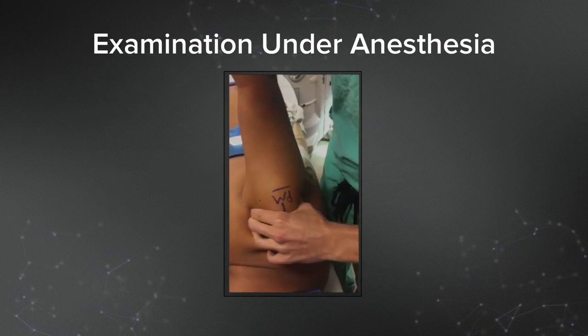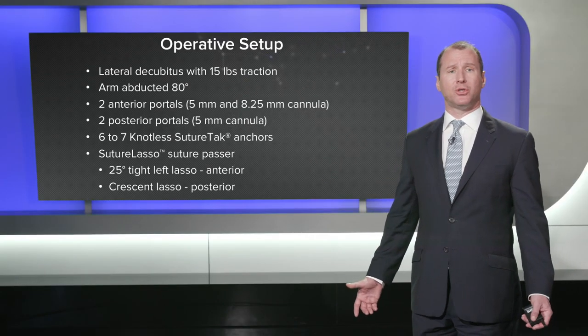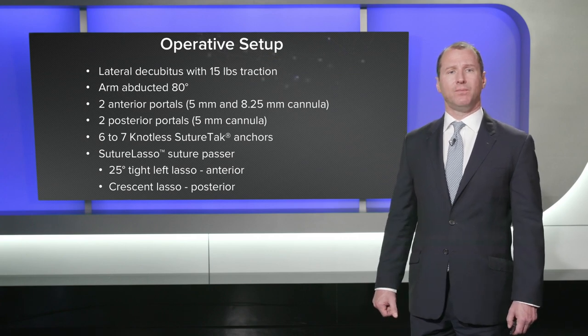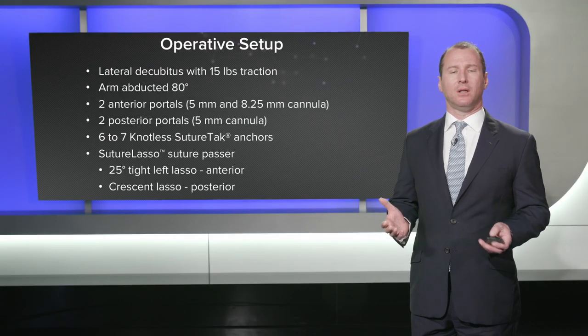Here you can see the examination under anesthesia, demonstrating significant translation over the rim both anteriorly and posteriorly. Our operative setup for a pancapsular shift is a lateral decubitus position with 15 pounds of traction. The arm is abducted to 80 degrees, which allows better access to the inferior pouch so we can get really low anchors. We typically use two anterior portals — a 5mm cannula superiorly and an 8.25mm cannula inferiorly — and two posterior portals: one for viewing from posterior and a posterolateral portal to perform the posterior capsulolabral repair and shift.